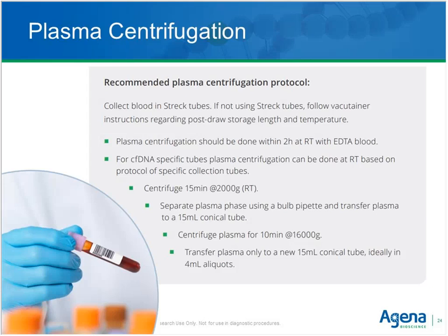Basically, you perform the dual high-speed centrifugation, where that separates the solid components of the blood from the liquid components, and the liquid component equals the plasma, and that contains the cell-free DNA components. Again, it is cfDNA as a majority, and a very little fraction is the ctDNA, so the tumor-related cell-free DNA, or this circulating DNA, so the ctDNA.